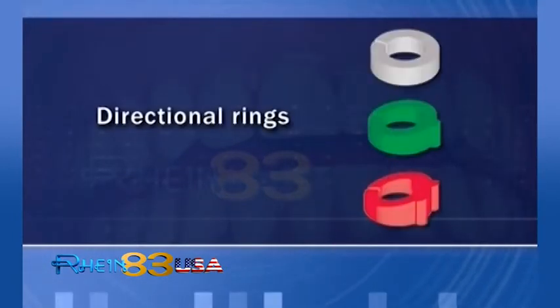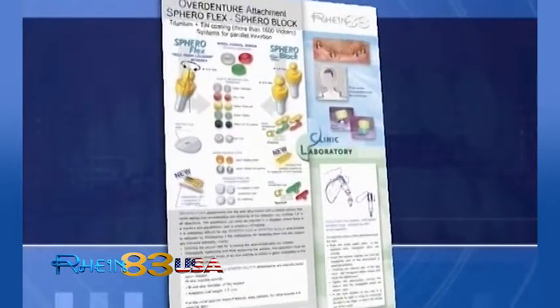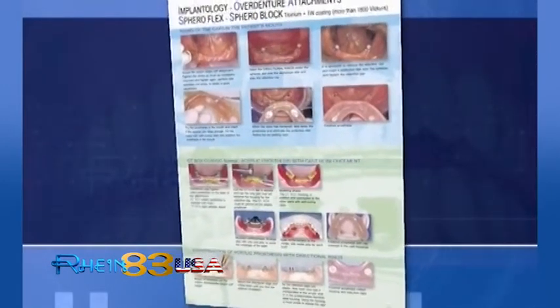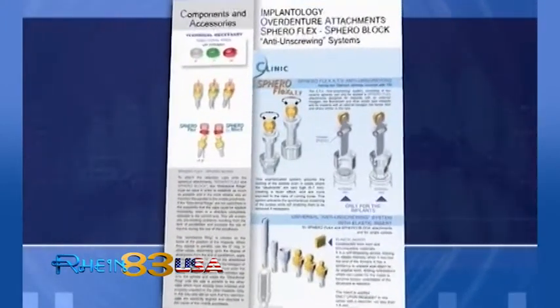Directional rings. It's critical to correct parallelism using SpheroFlex with swivel sphere and directional rings. See catalogue pages 30, 31, and 32. Overdenture abutments for implants can be customised for every implant brand on the market.